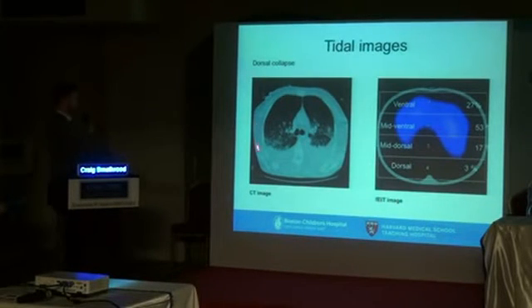So over here is obviously a pretty fancy CT image that we're very confident in and really high resolution, but we're going to have to expose our child to radiation in that case, and also send them off to the radiology department, and that's not always feasible with our critically ill children. But we could, however, apply these electrodes to the patient non-invasively. There's no harm to the baby outside of perhaps some skin irritation, but hopefully we can mitigate that with good care. But this is what the image looks like.